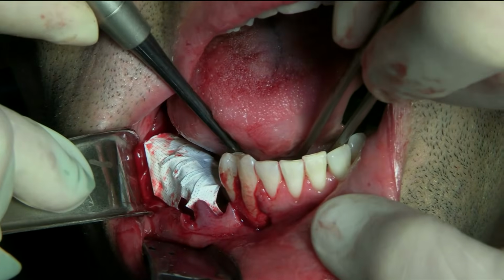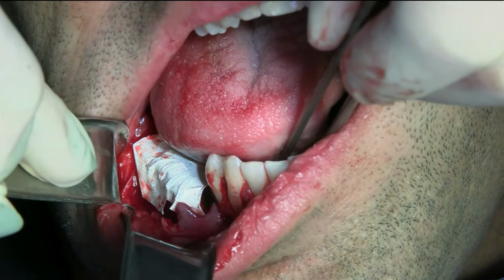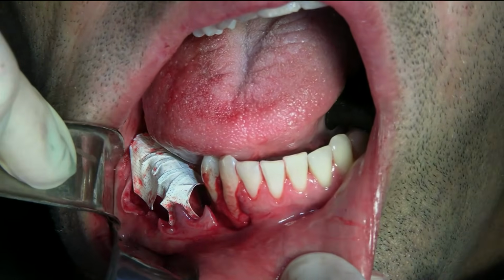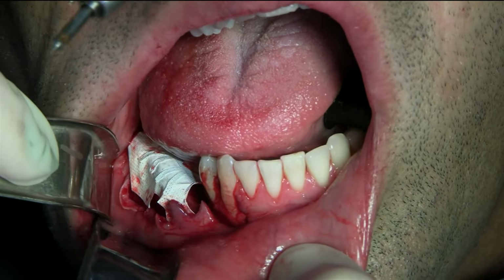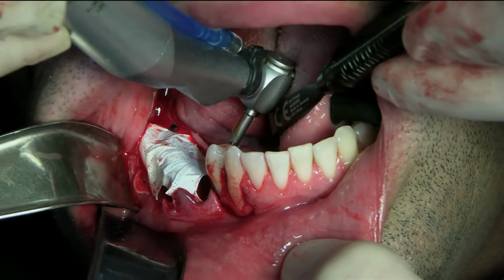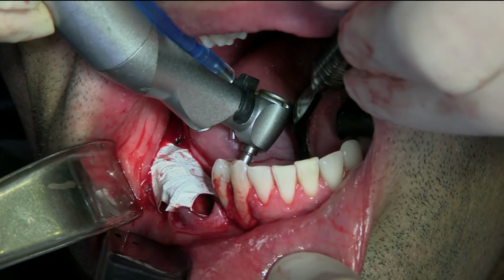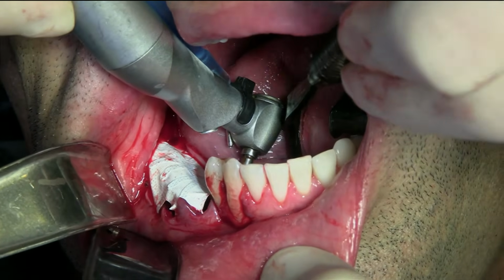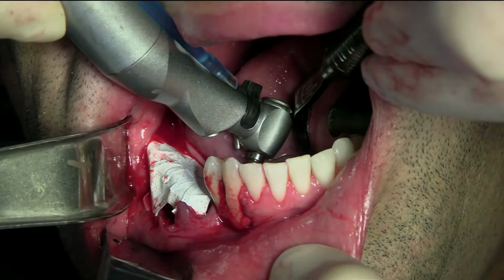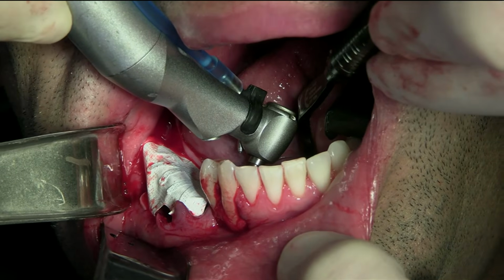Okay, if I can get down there. Let's see, handpiece. Now this would not be possible without the handpiece, because I need to get lingually. I need to squeeze past the tongue. Okay, let's see.